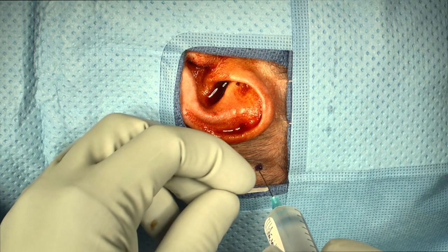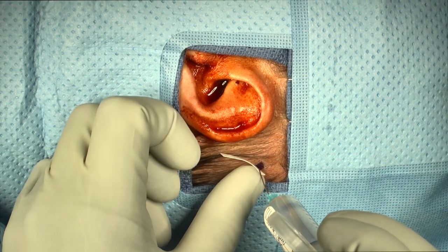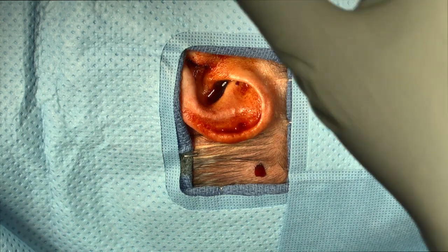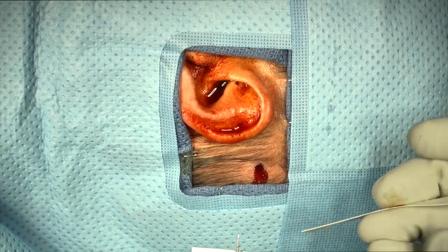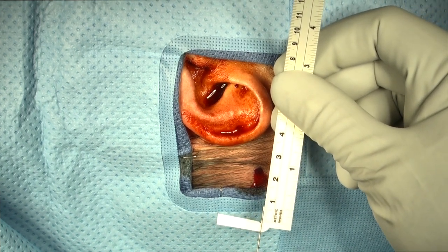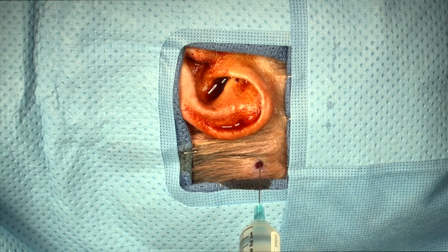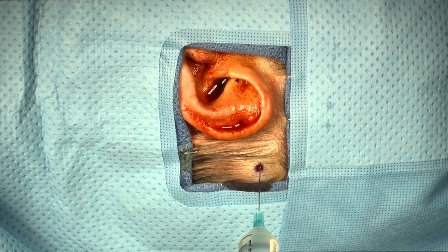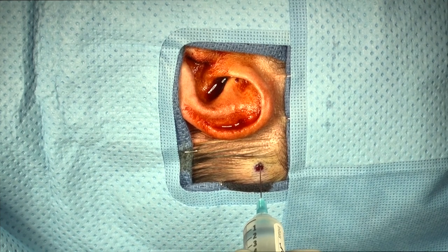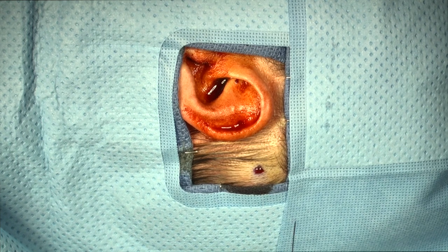Next, a needle can be used to mark the thickness of the subcutaneous tissue, which can help with post selection later. A needle is passed through the subcutaneous tissue to the bone and the skin level is marked. The length of the needle is then measured — in this specific case, we measure a length of approximately eight millimeters, so a longer post will be required if no undermining of skin is performed. An injection of 1% lidocaine with 1:100,000 epinephrine is then performed for anesthetic effect as well as vasoconstriction. It's important to measure the thickness of the underlying subcutaneous tissue before injection, because the injection will inflate the tissue and result in an inaccurate measurement.